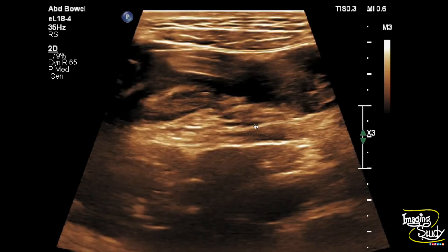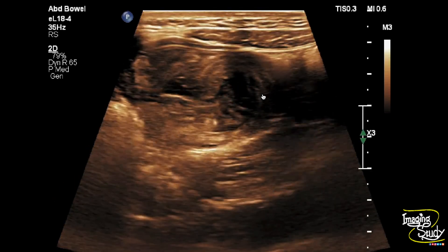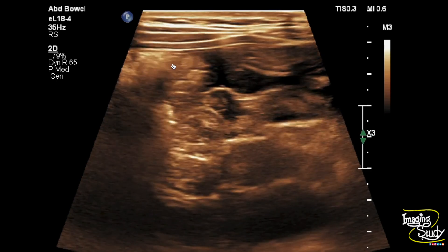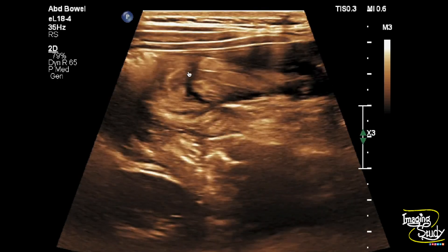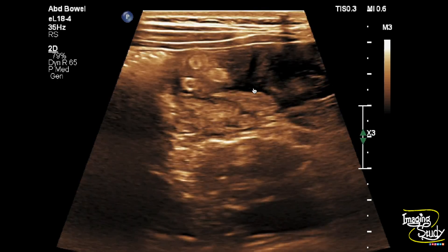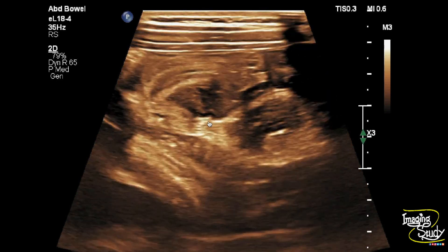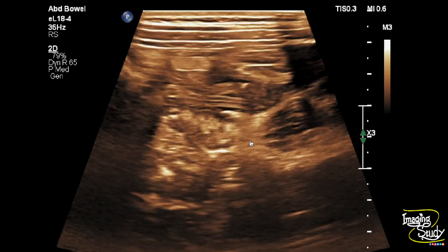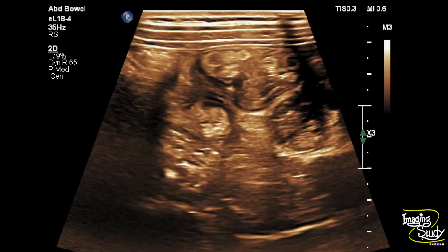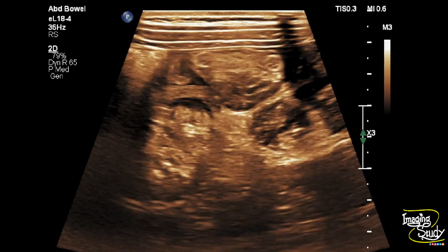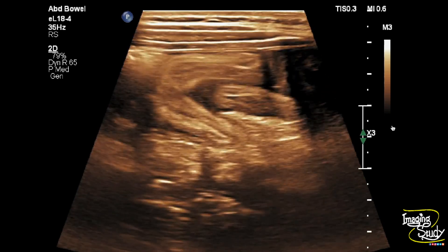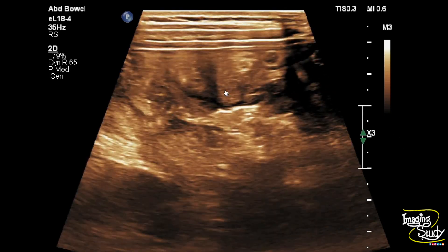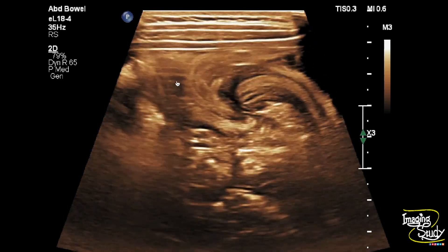Here on high frequency view you can still see this linear tubular structure with the outer margin being echogenic, and they are moving here. So these linear tubular motile structures are Ascaris lumbricoides within the small bowel lumen.